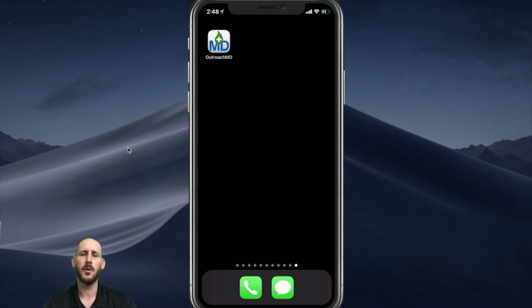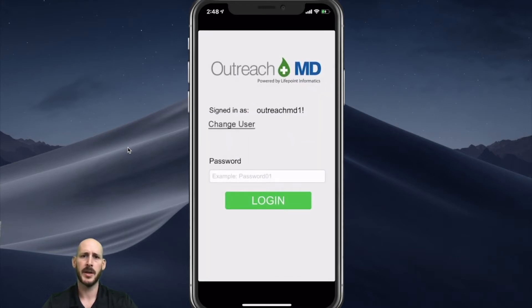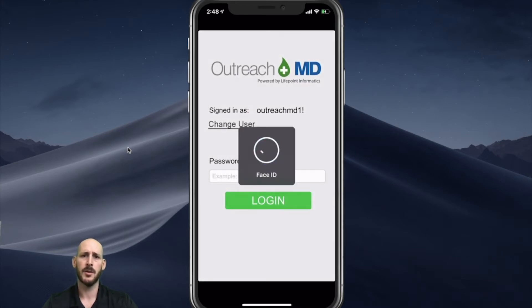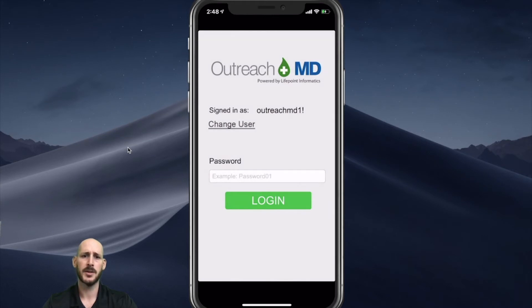Before I log in, I'll mention that I'm utilizing the face ID, but alternatively you can type in your password or utilize touch ID, depending on your device.